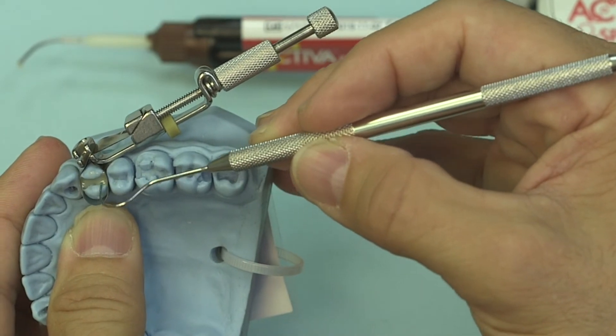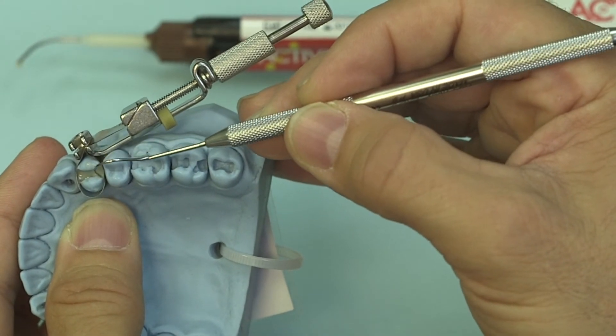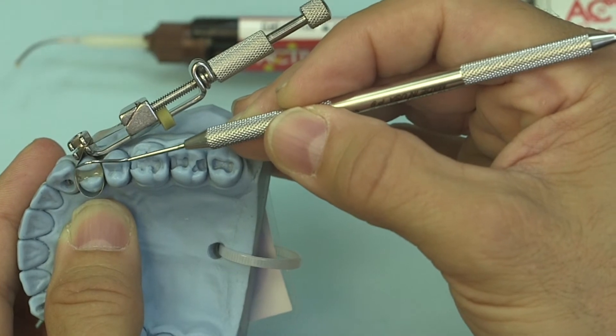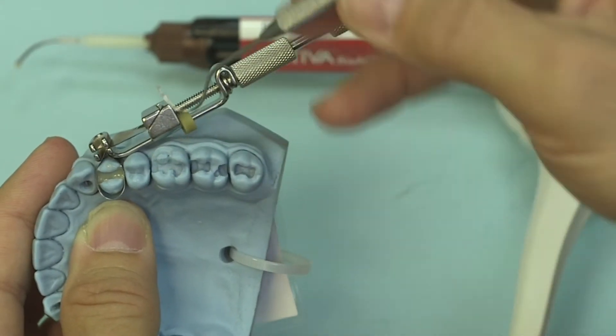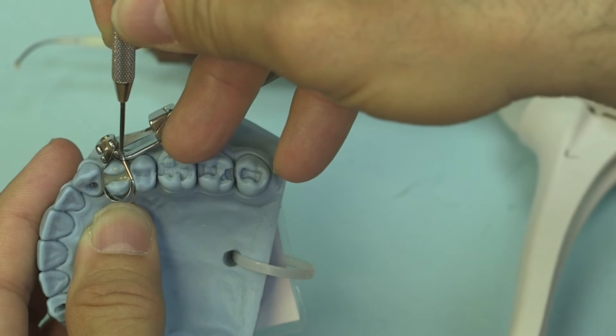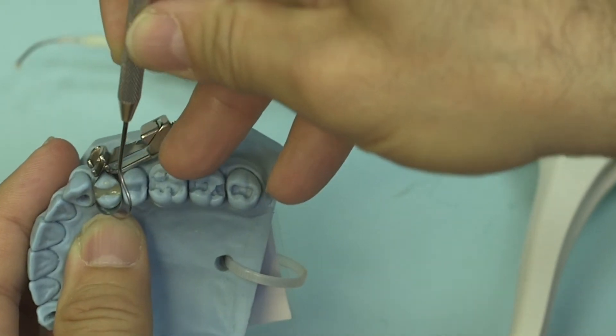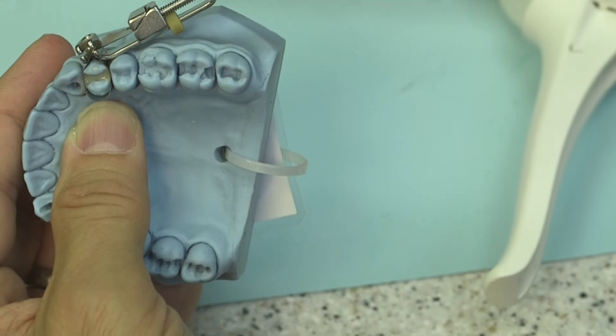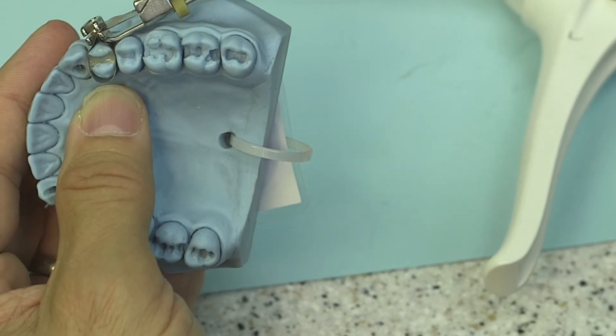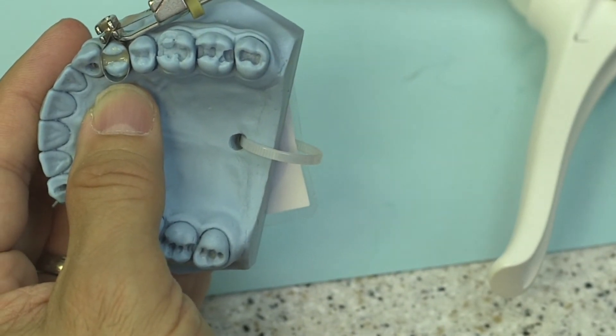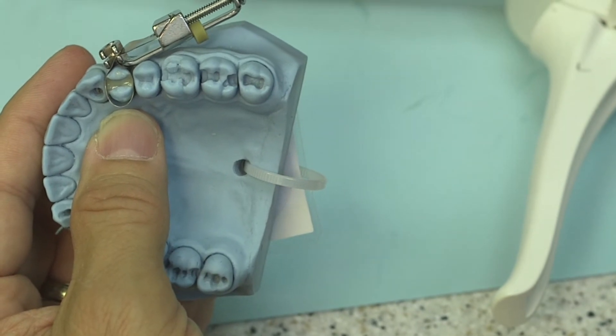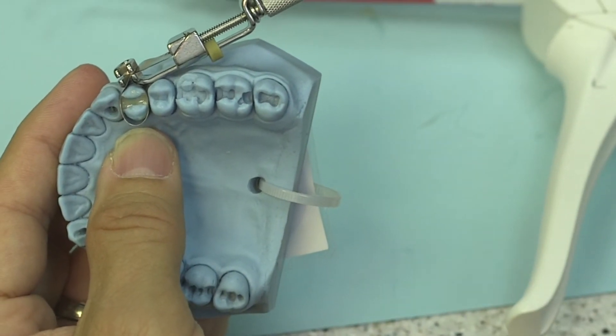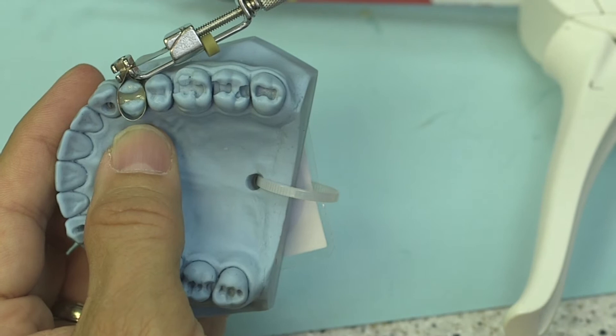Try not to play with it too much because when you fill up the interproximal boxes the way that I just did, you're going to get a very nice seal all around. If you want to check the interproximals depending on where your band is allowing you to go, you can certainly do that. Now I'm not completely filled. I've got about a millimeter or two or so onto the pulpal floor and the boxes are filled just to about the contact area.